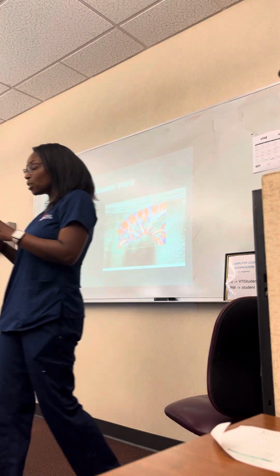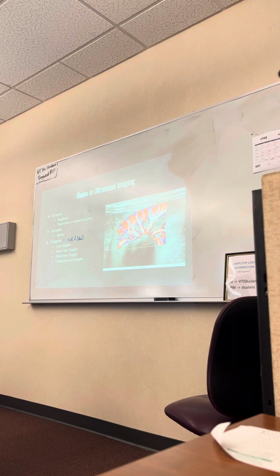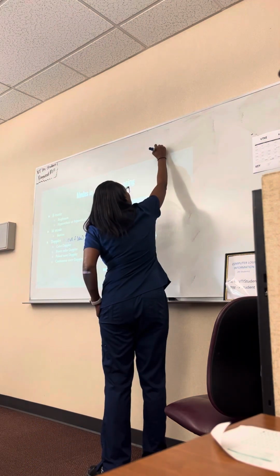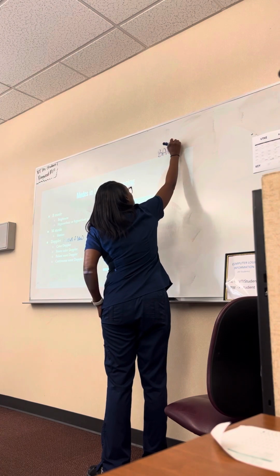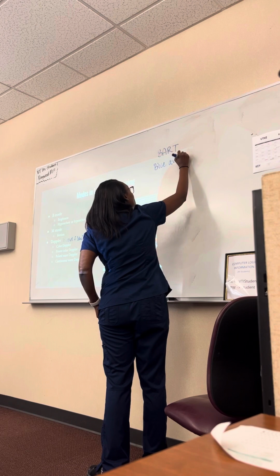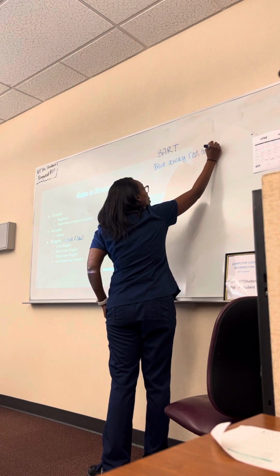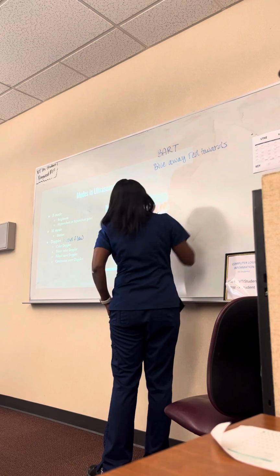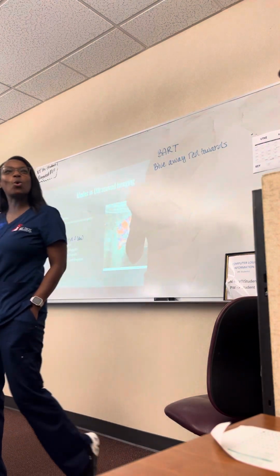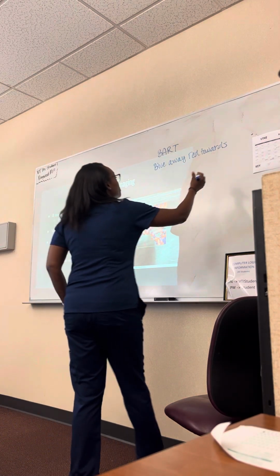So one thing that you guys could remember for terminology for the color Doppler is a term called BART. That means blue away, red toward. Towards. And that's talking about the transducer.